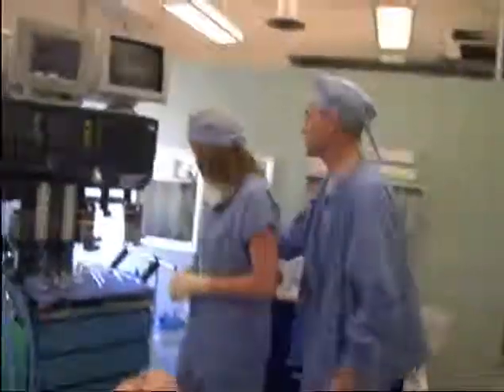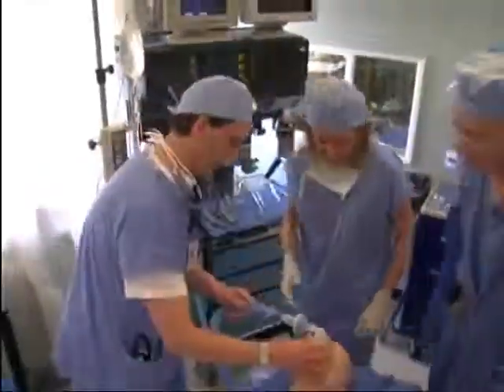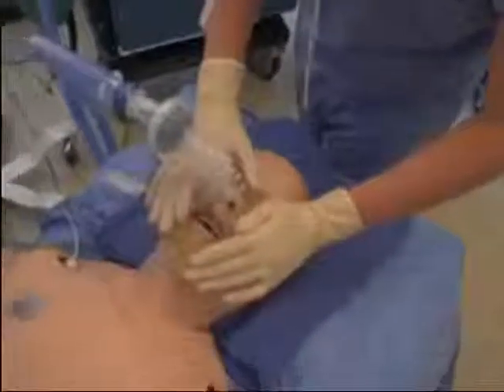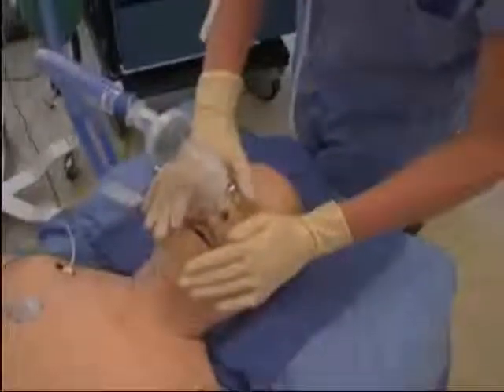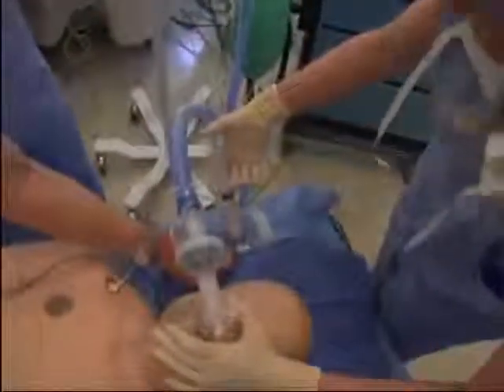So the first thing we're going to do is have him start breathing some oxygen, and then we're going to hold this mask on the patient right here. So he can see that he's awake. Yeah, he's awake. Just hold it nice and gently. We'll ask him to take some nice big breaths. She's turned that stopcock. And Chris, you're going to get nice and sleepy now.